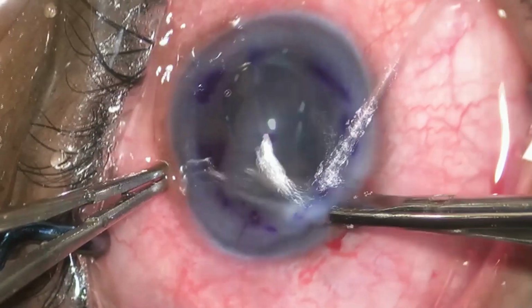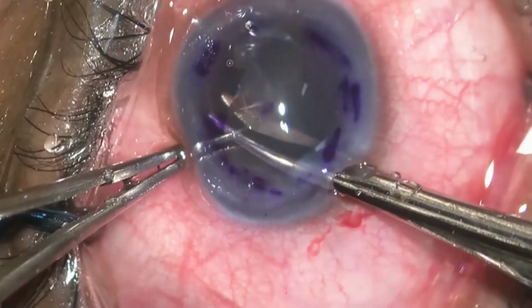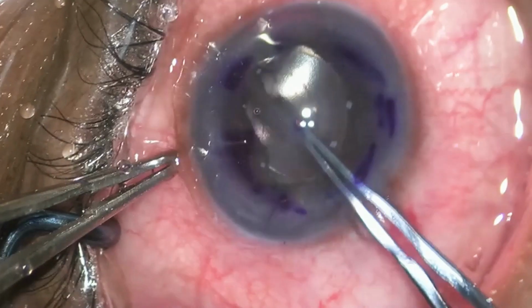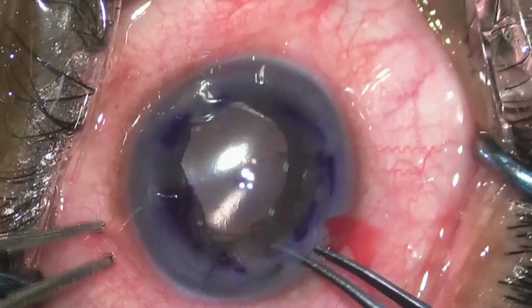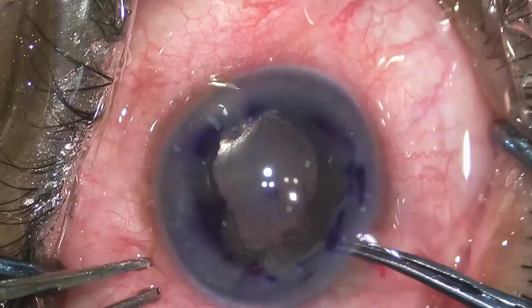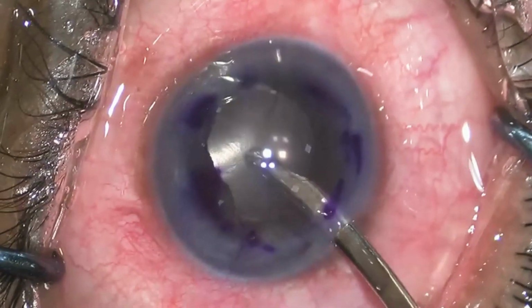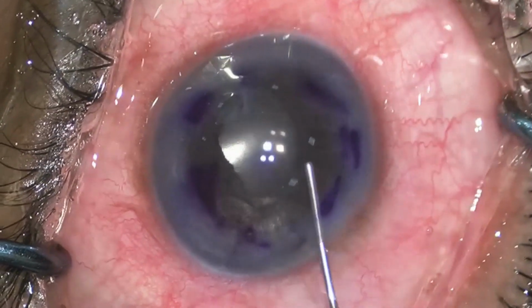Still, there is some Descemet membrane attached to the iris, which is cleaved using the Vannas scissor. The remnant Descemet membrane is removed using the forceps. Visco wash is performed. 0.2% pilocarpine is injected to bring down the pupil size.